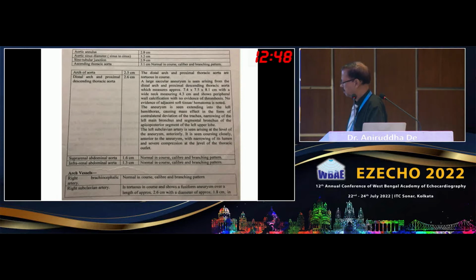Very well. You have that blind spot on the anterior arch only. Yeah, that too, a part of the arch. Absolutely, the neck attachment is just beyond the subclavian artery, just beyond the subclavian. Very well seen. So close to the isthmus is the break point. Just below the isthmus.